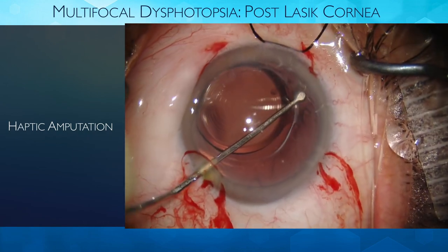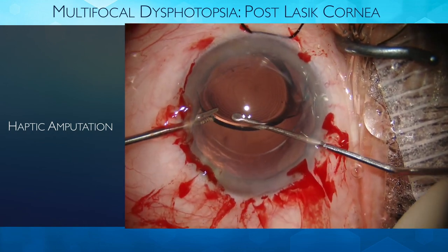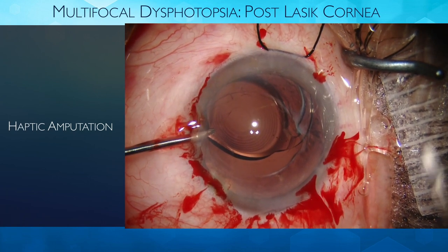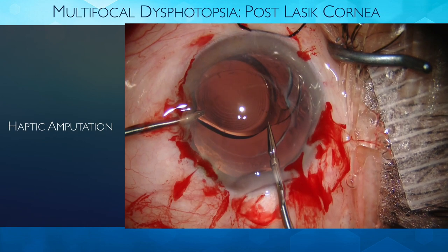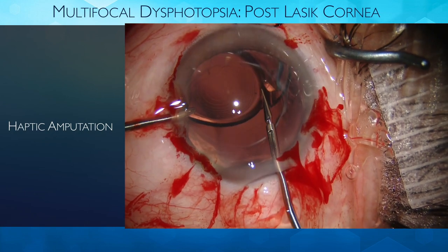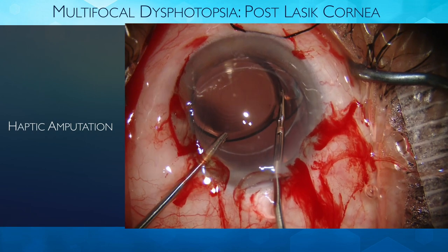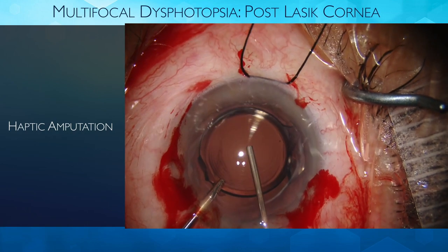We got one side free. The other side is really fibrosed. We don't want to pull, so we can try counter-traction. In this case, we've decided to cut the bulk of the free haptic and optic out, and then either keep the haptic that's fibrosed in the bag or try to get it out. We're taking our 23-gauge scissors to cut. Notice we need to grab closer to decrease the flexion on the zonule — cutting too far out was causing zonulopathy. Grab closer and cut more peripherally to reduce stress on the zonule.